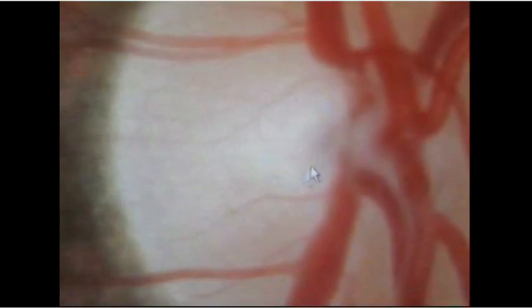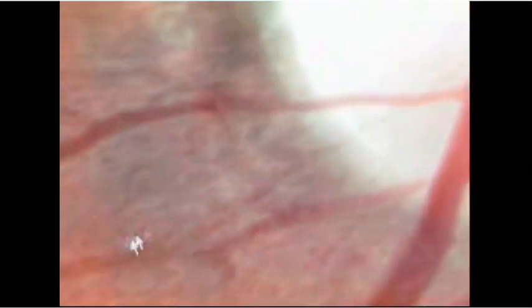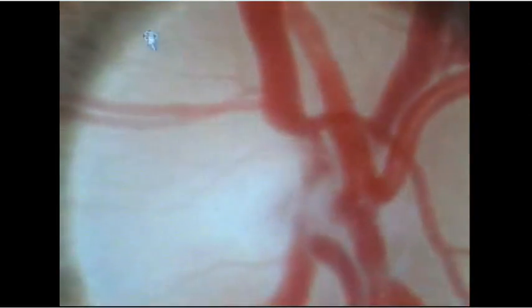This cup, of course, is minuscule, but the arteries are clear, the veins are clear. I can see if there were nicking in the crossing, I can see if there were focal constriction in the veins — that's an artifact on this camera at the moment. But as you can see, what an accurate view of the retina we can get through an undilated pupil. It's just really fantastic.